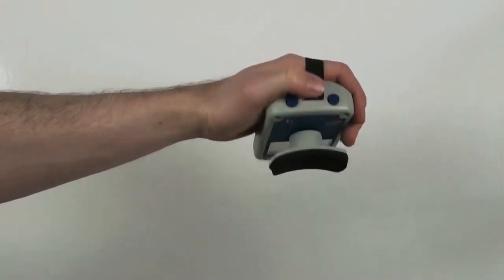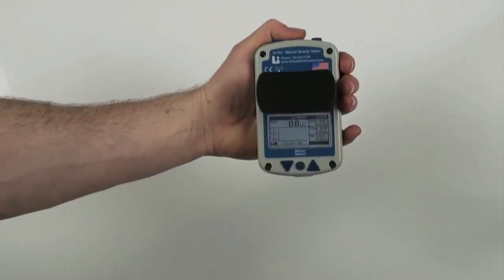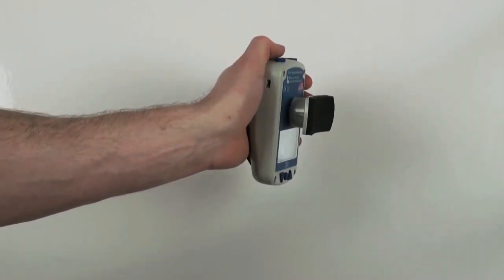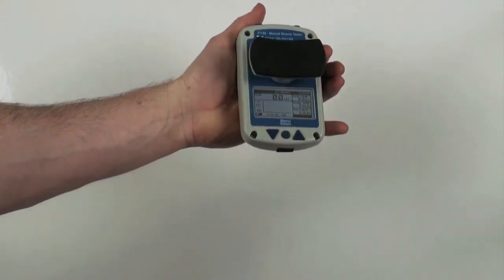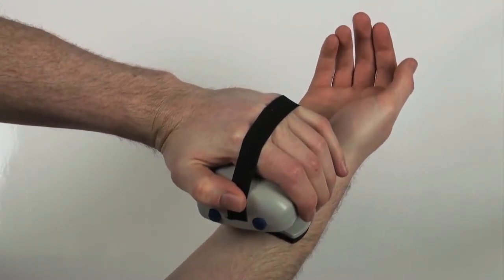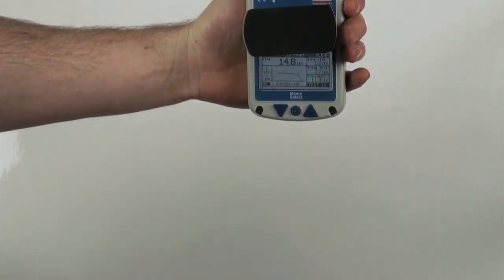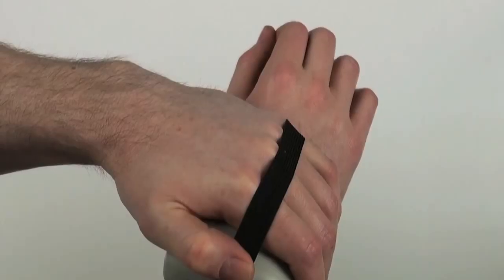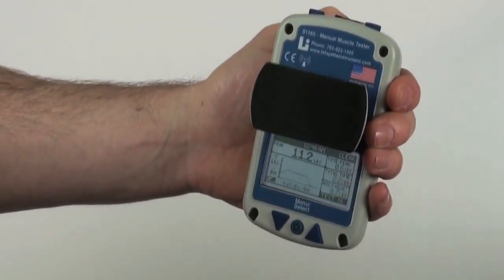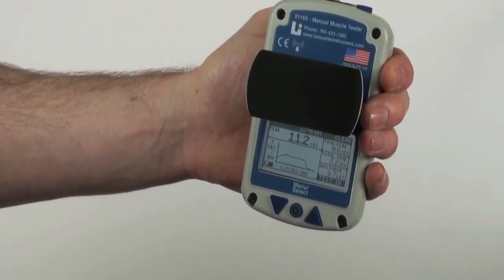The Lafayette Manual Muscle Tester System is an ergonomic handheld device used for objectively quantifying muscle strength. The test is performed with the clinician applying force to the limb of a patient. The object of the test is for the clinician to overcome or break the patient's resistance. Measurements are taken by pressing the padded stirrup against the muscle being tested. The force and time data are displayed on the LCD screen on the face of the MMT.